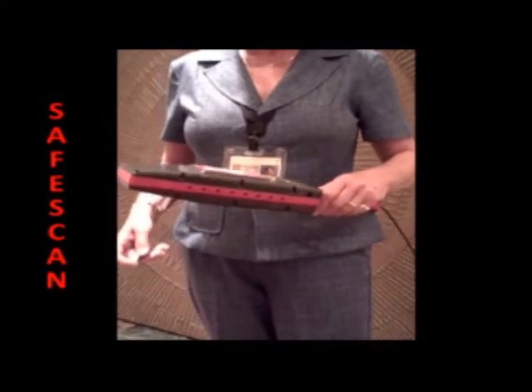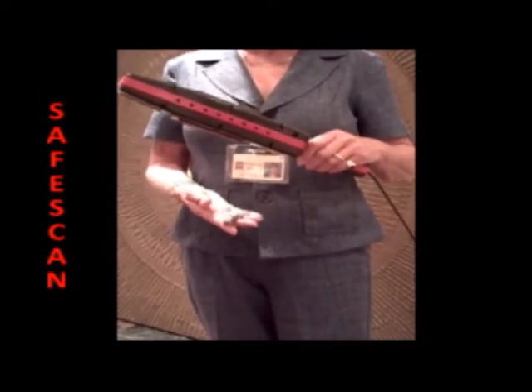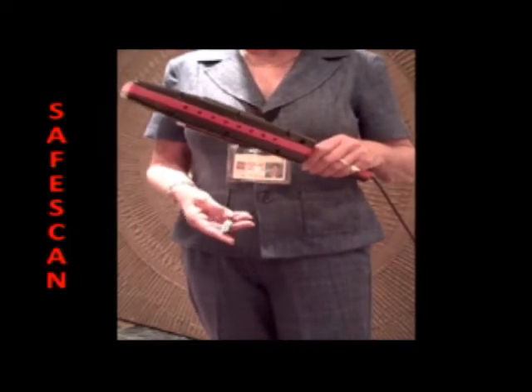Next, we will show a demonstration of ferromagnetic detection with the SafeScan target scanner. For instance, here is a nail clipper.